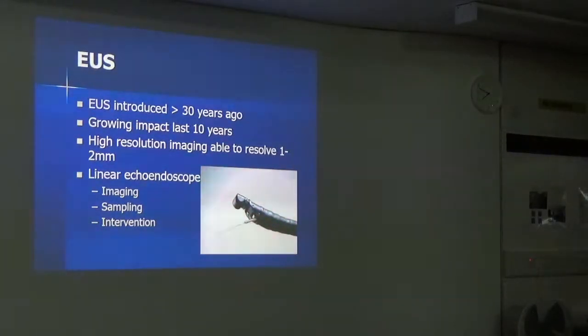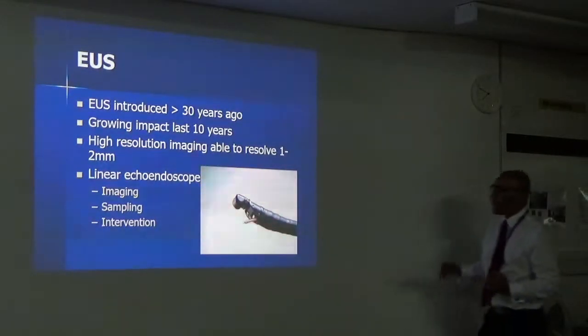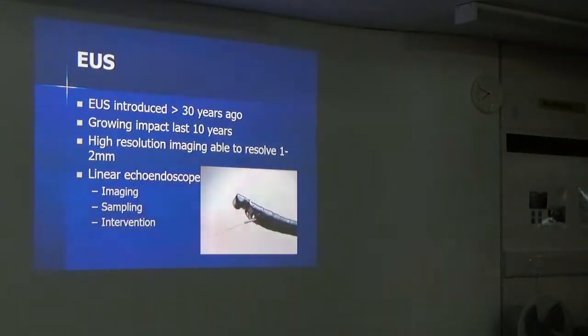And because it's got a channel on this instrument, you can see a needle coming out, so you can actually take biopsies, you can do interventions, you can drain collections, and as I'll show you later, one of the new techniques that's been developed is actually to measure the portal pressure in patients with liver disease, and I'll discuss it in more detail, that's at a very early stage, but I can envisage in the next 5 years or maybe a bit longer, it will be a technique that's used much more commonly.